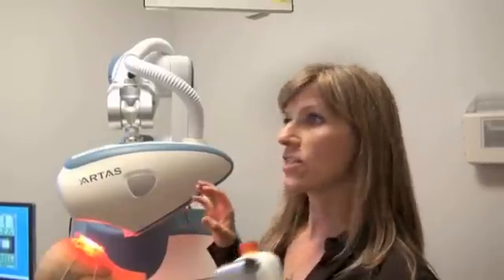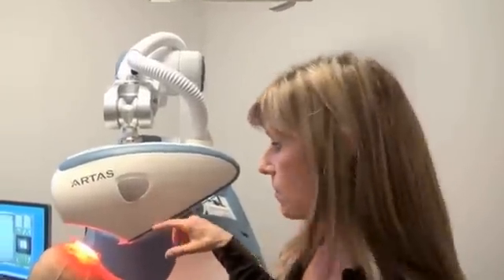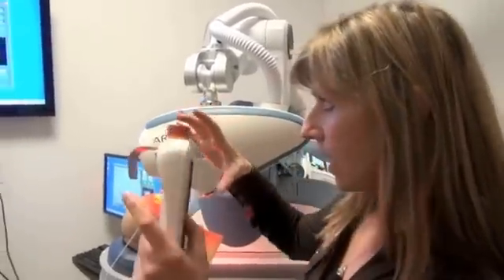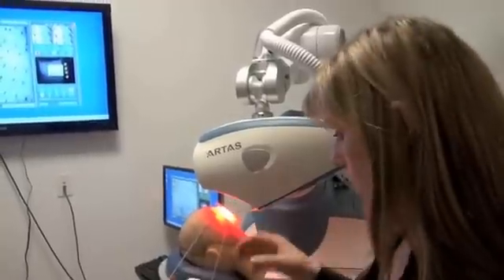Today I'll talk about the visual system of the ARTAS system and how the system will align itself and find the field where surgery should be performed.